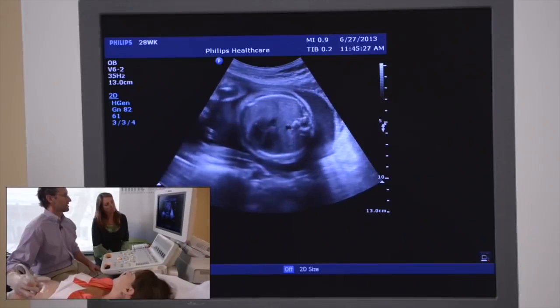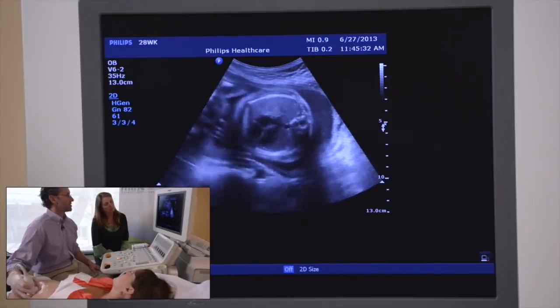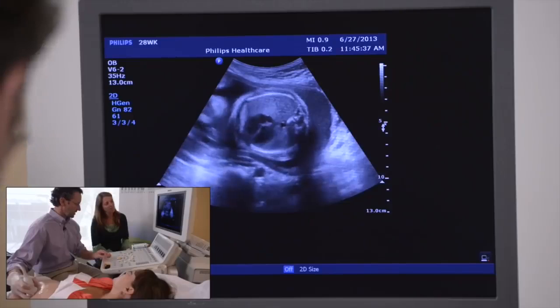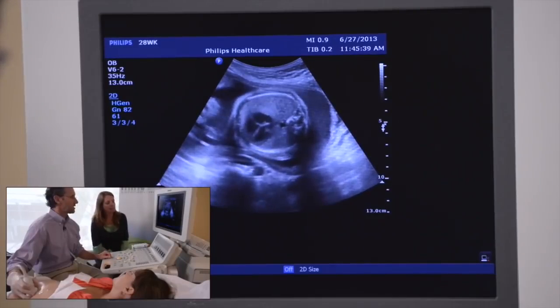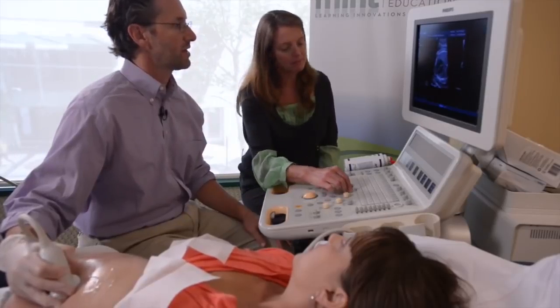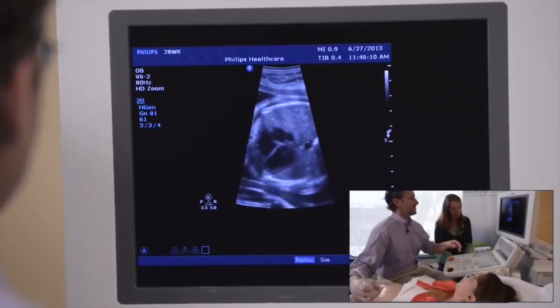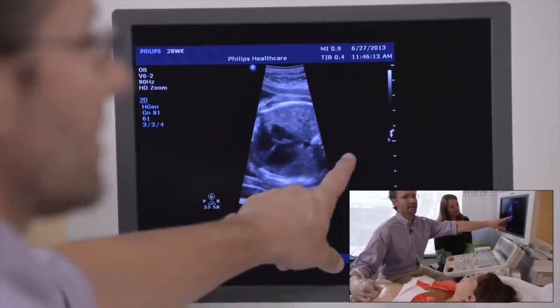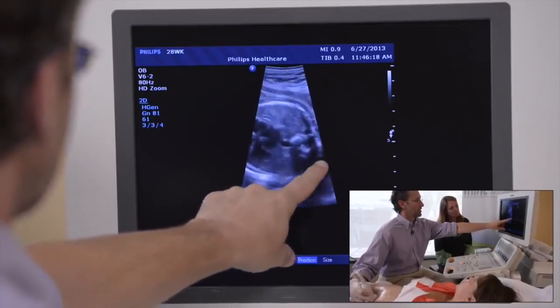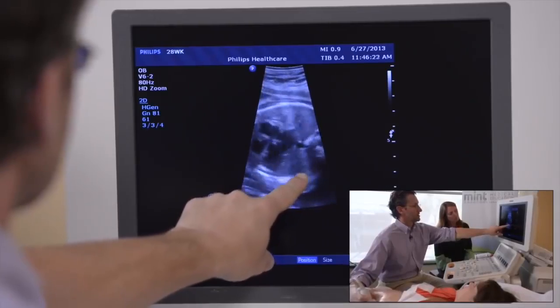As we do that, there are a few checklists we want to see here. I'll go over this more in a lecture format, but that shows the fetal lung tissue nicely in that picture. We've zoomed up a little bit on the heart here, and there are a few things we want to notice. First is the axis of the heart. So if you draw a line right from the spine, which is back here, shadowing bone, sorry, this is a little bit tight.